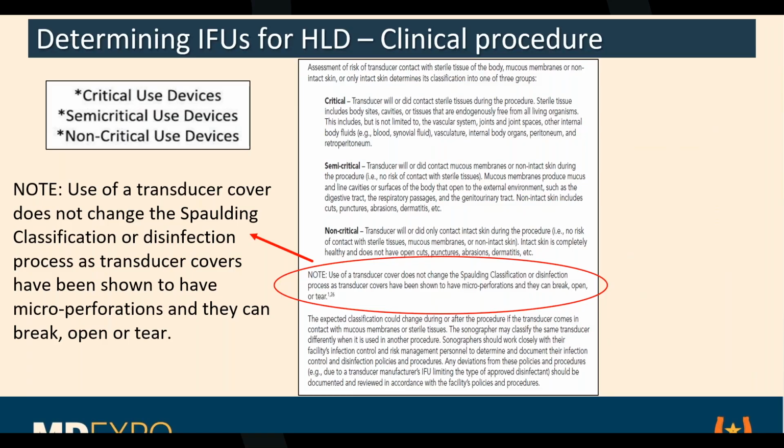I've been doing this for 20 years and I've never seen that once. Great. As a physician, you ought to know that one, you're an anecdote, you're not data. They're looking at actual data over a bunch of people. So maybe you were fortunate enough not to have that, but that's not what the FDA thinks. Perforations can break open and tear, and they do.